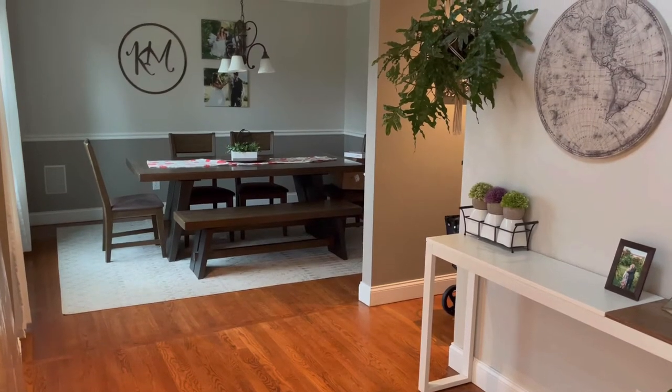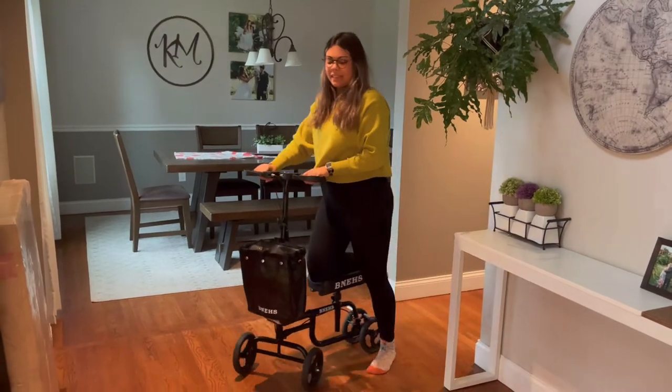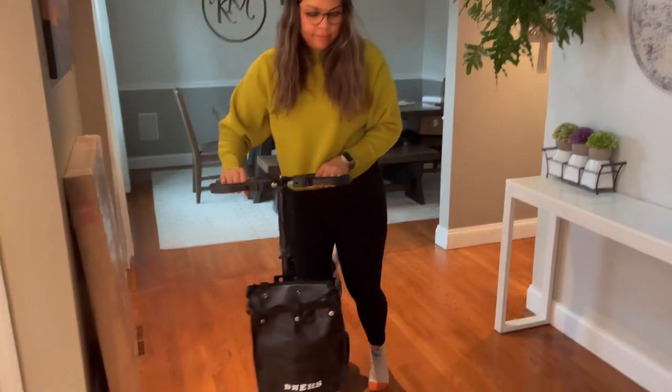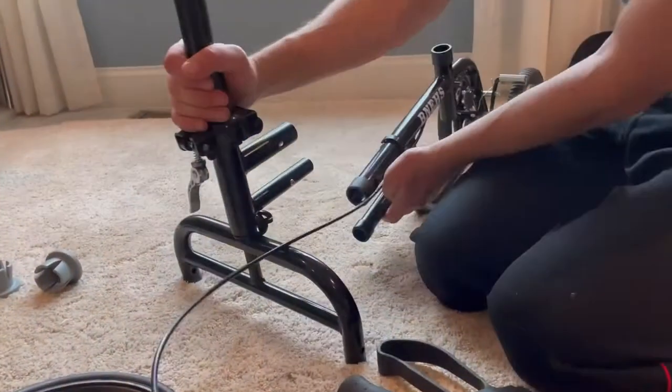Unfortunately, I have recently injured my ankle during a volleyball practice, so I am stuck to this knee walker for the time being. I love the fact that I still have the freedom to move, even though I cannot currently utilize my ankle.